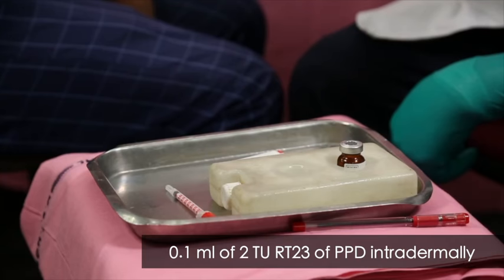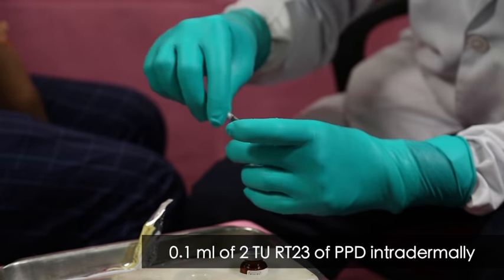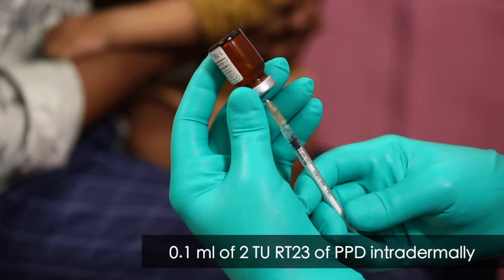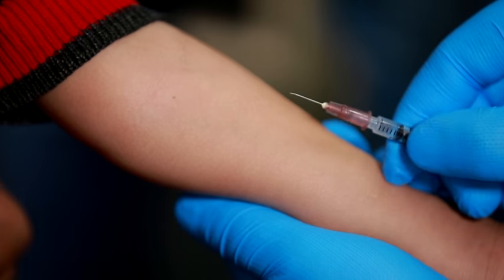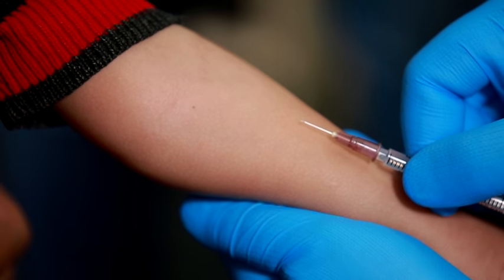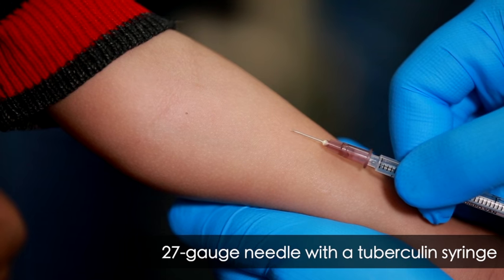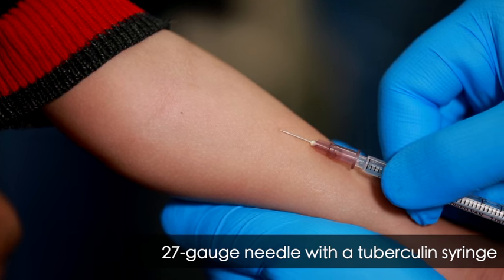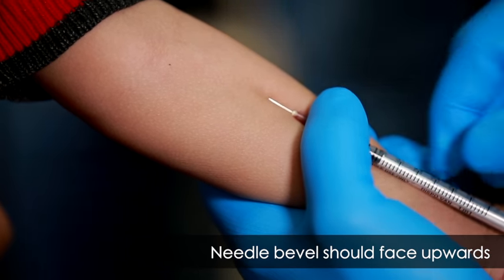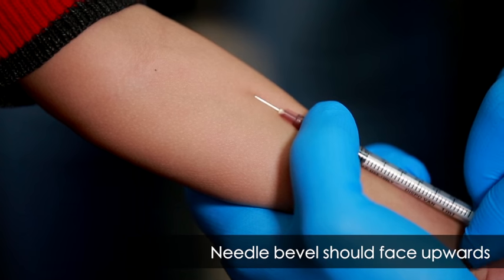TST is administered by injecting 0.1 ml of 2TU RT23 of PPD solution intradermally. If 2TU is not available, no more than 5TU should be used. The PPD should be injected using a 27 gauge needle with a tuberculin syringe, with the needle bevel facing upwards. Avoid areas of skin with veins, rashes, or excess hair.